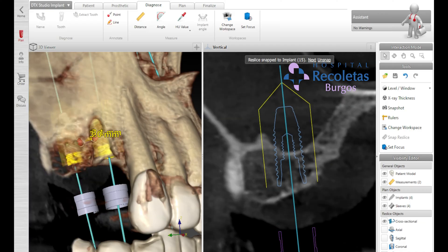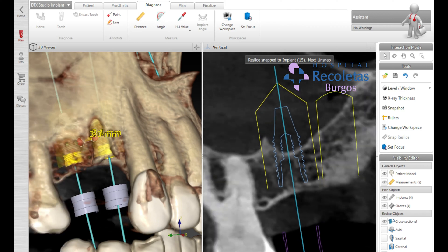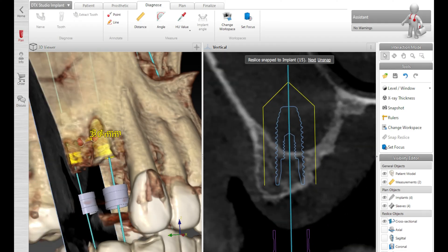As you can see, this is a very good sinus for grafting. We have a minor septum over here, but still I think we should be able to elevate the sinus membrane without any issues. We're going to do this in theater. It's a patient in her 60s and she's been without this premolar for over 15 years or so. No significant medical conditions.